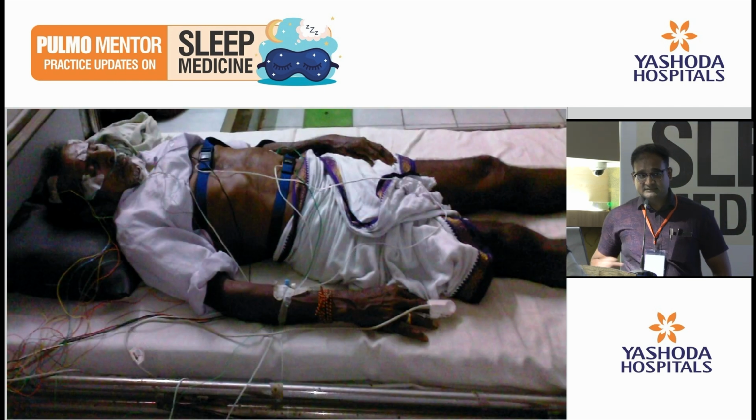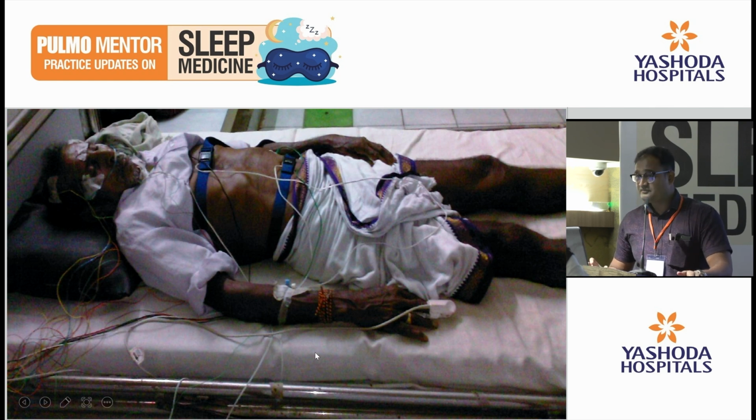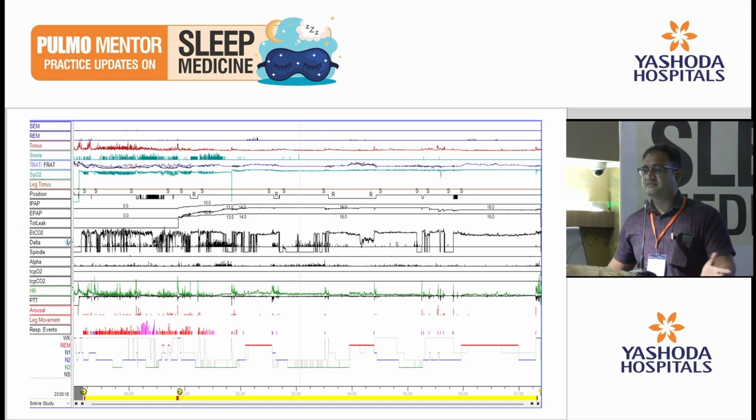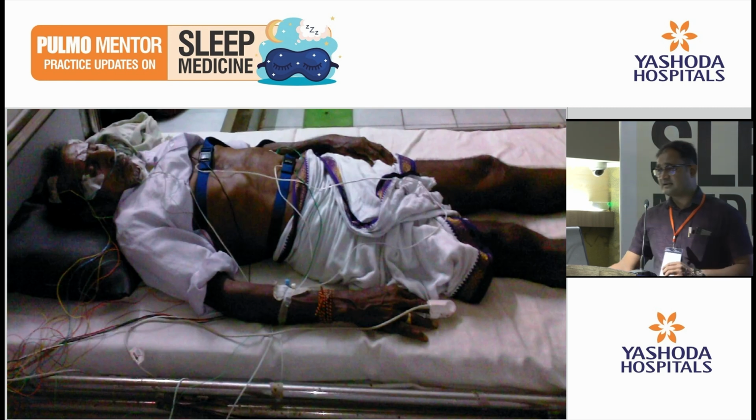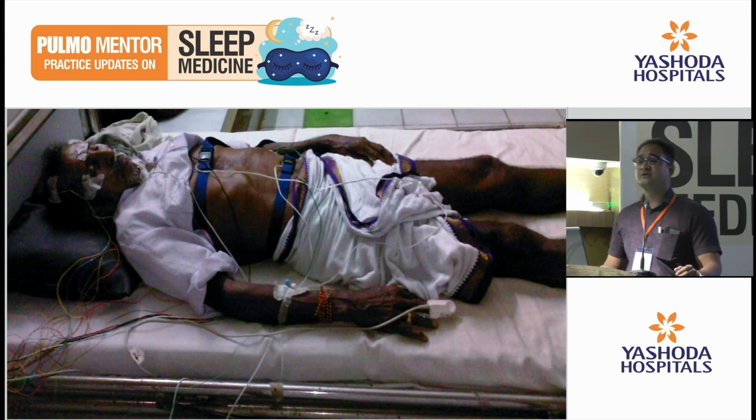Here you can see a patient undergoing polysomnography. A lot of leads are attached to monitor EEG activity, EMG, EOG, abdominal and thoracic belt, saturation, and pulse oximetry. Depending upon the channels and parameters used, there are different kinds of sleep studies, like level 1, 2, 3, 4. This looks simple, with some leads attached to a patient while sleeping and undergoing a sleep study.